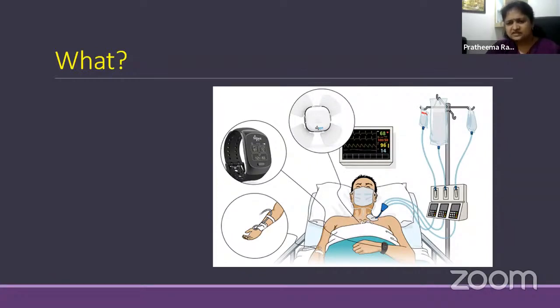So there are various variables. We are giving oxygen through the lungs and the tissues are elsewhere. It is the duty of the heart to pump properly. There is a pump or a motor, which is the heart. There are many tubes. It is basic plumbing. The arteries are the tubes, and there is a tank, the venous capacitance or all the veins. We call it a tank because they are reservoirs. So is the pump working well? Are the tubes working well? Is the tank getting filled or is it half full? This is what the whole hemodynamic monitoring is about.